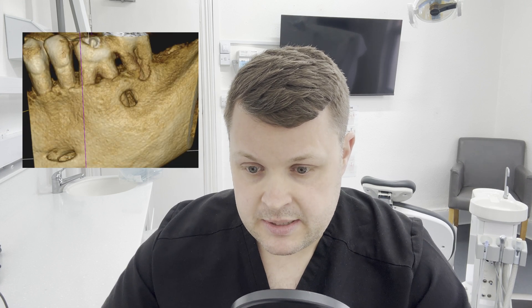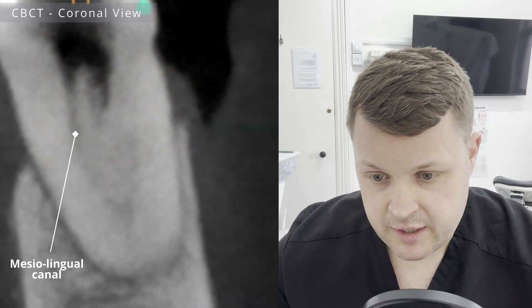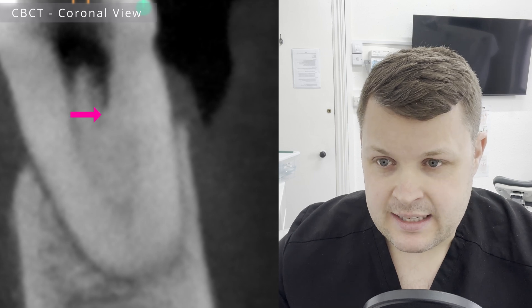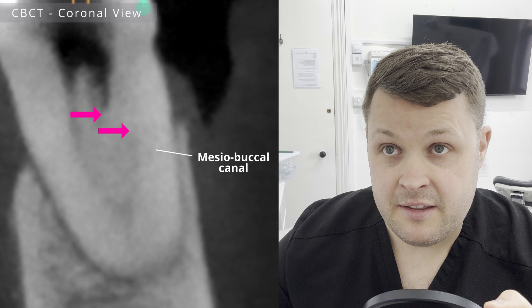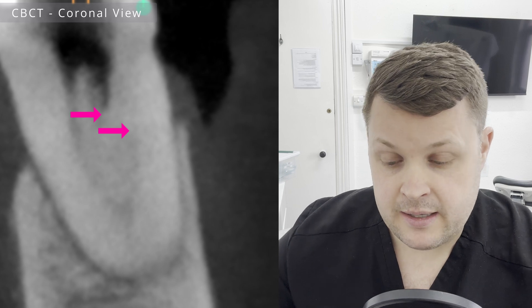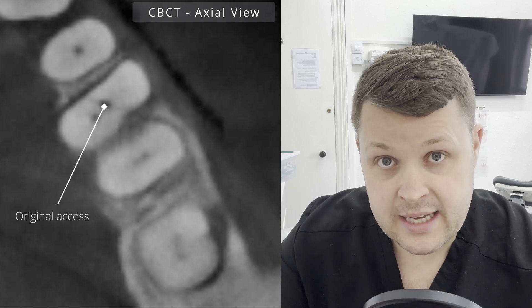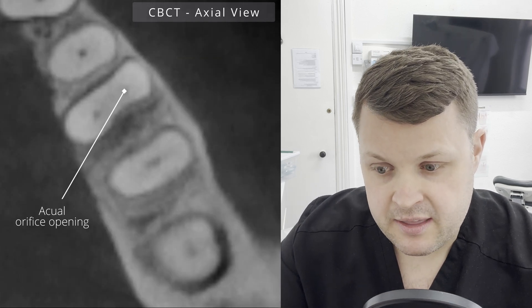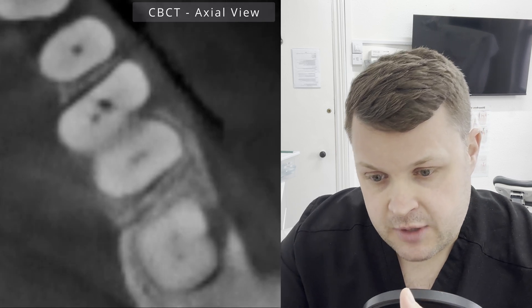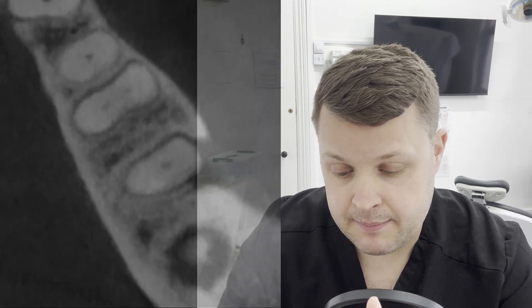So it's at this point where I'm thinking a CBCT image needs to be taken. And if we look at the CBCT image here, we can see that the depth I have created with my ultrasonic tips is kind of at the point of where the canal is. But I am actually too mesial. The great thing about these CBCT images is that you can have a look at where the canal is and orientate yourself. I know there's a big thing at the moment about CBCT images and they don't really work well for sclerosed canals, but I can see that in this case it's perfectly orientated my instruments.